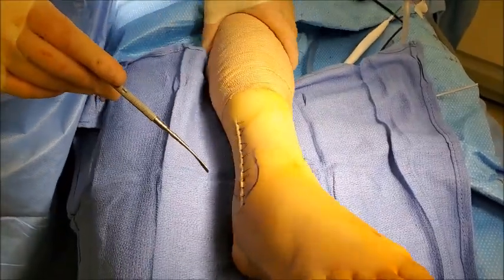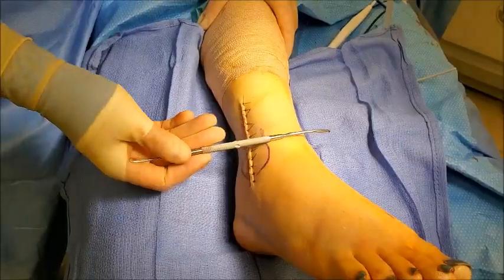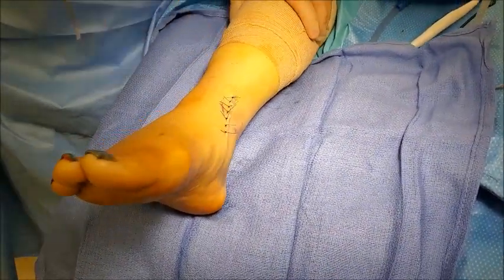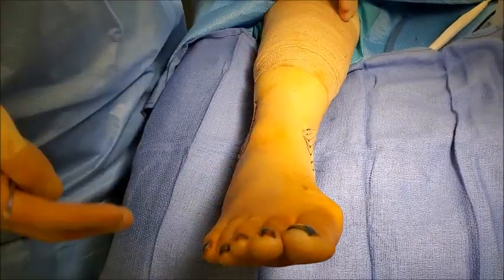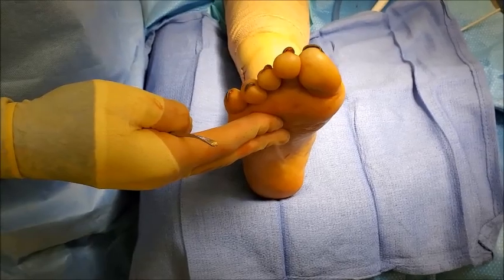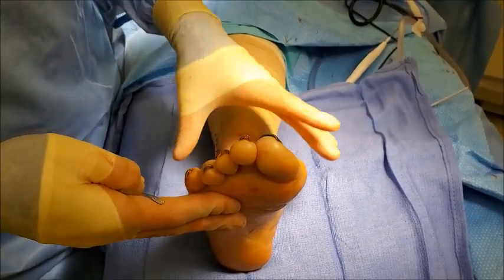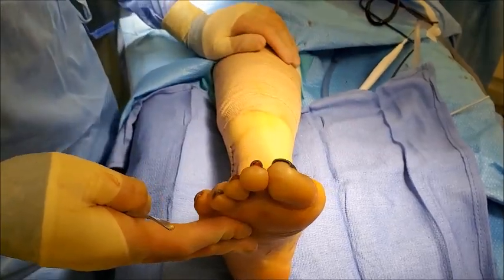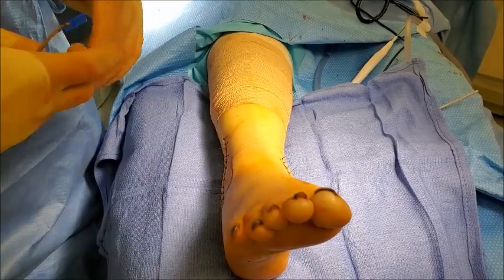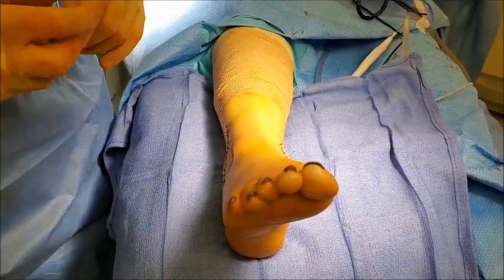We've completed the procedure and you can see an incision on both sides of the ankle — one where the fibula was repaired and the syndesmotic anchor was placed to hold the two long bones together, and one along the medial malleolus. We'll put her in a splint, which is a hard-backed device to hold her foot with ACE bandages, and she'll wear that for two weeks. Sutures come out at two weeks, then we'll transition into a below-the-knee cast for an additional two weeks. Total non-weight bearing time for this patient is usually about four weeks, at which time an x-ray will determine if we'll let her walk in a boot.